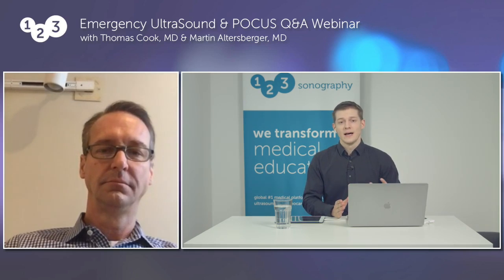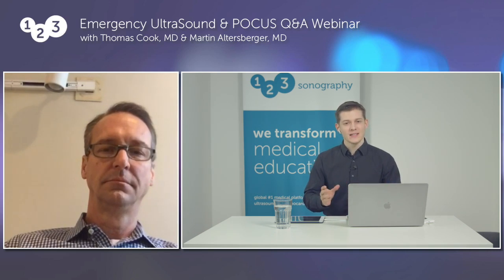Great. I also think that is the perfect answer. I would maybe also add the McConnell sign. Sometimes you can see it. Sorry, now I'm at the pulmonary embolism. There was another question coming in. I'm really sorry, Tom. Pulmonary embolism also, the McConnell sign. For the pericardial tamponade, if there is some kind of fluid and the right ventricle is compressed and not able to expand, then you have the diagnosis. So I think time went by really quickly.